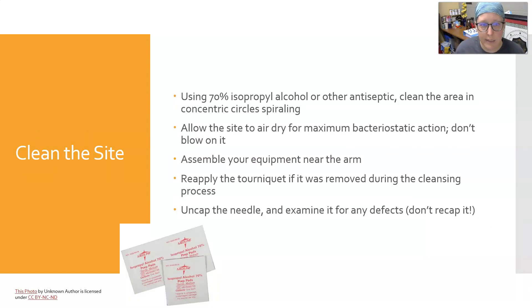Next you're going to clean the site. Use 70% isopropyl alcohol or another antiseptic — isopropyl alcohol is the most widely available, cheapest, and very effective. Clean the area in concentric circles spiraling outward, starting in the middle of the site and going round and round, bigger and bigger, cleaning outward. Allow the site to air dry for maximum bacteriostatic action and don't blow on it.